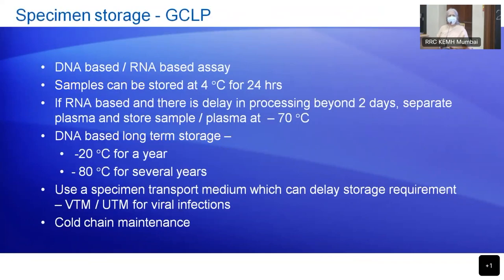So what are the storage conditions that are possible? Almost all samples can be stored for 24 hours at 4 degrees Celsius. Beyond that, it depends upon the target nucleic acid that you are detecting, whether it is DNA-based or RNA-based. An RNA-based assay sample should necessarily go at -70, and a DNA-based assay sample or the eluate that you get can go at -20.